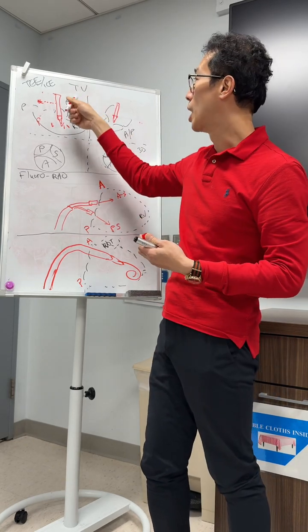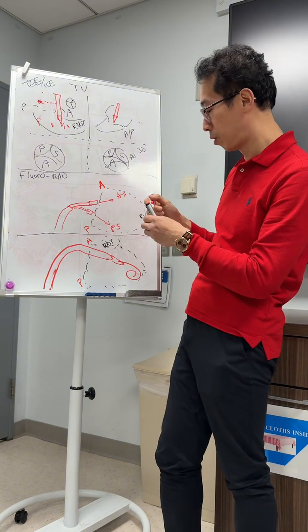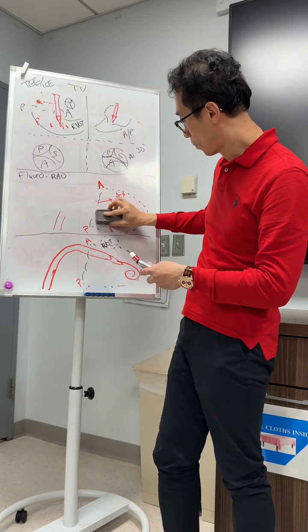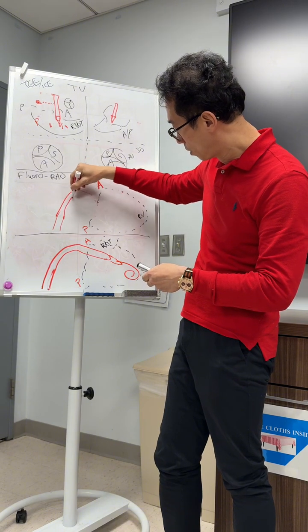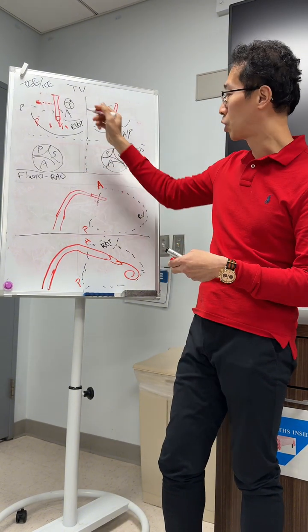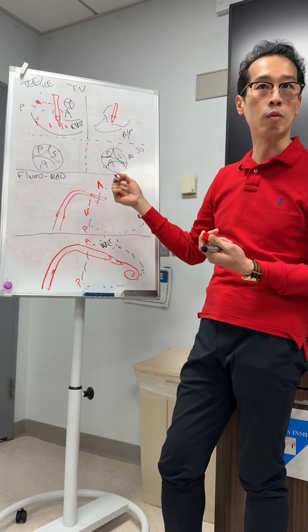Now, with TTVR, it's the same thing, actually. So how do you know on fluoro, just before we move on? You would see on fluoro that your device for the TTVR is here. It will move back. Let's see, it's here. So you need to retract the stabilizer and the whole system to go more central or posterior, whichever your target is.